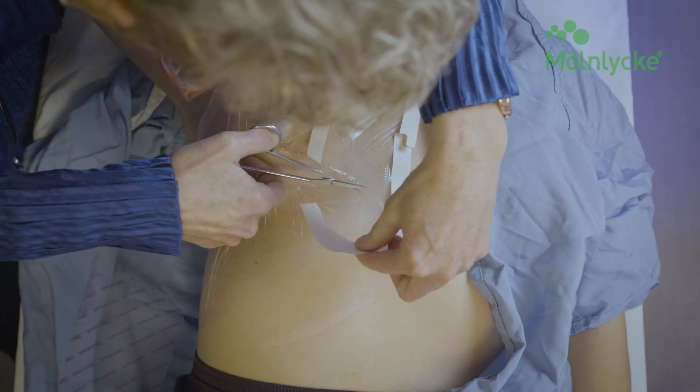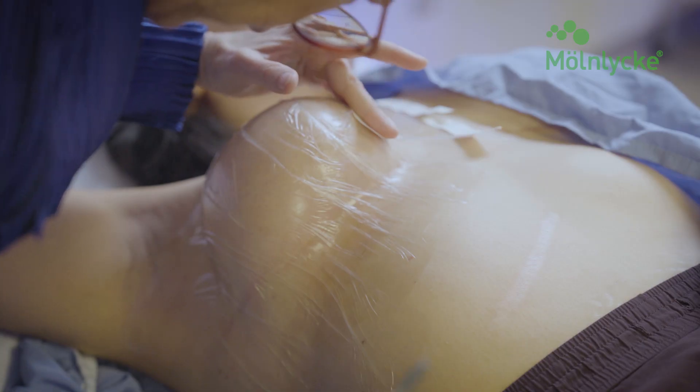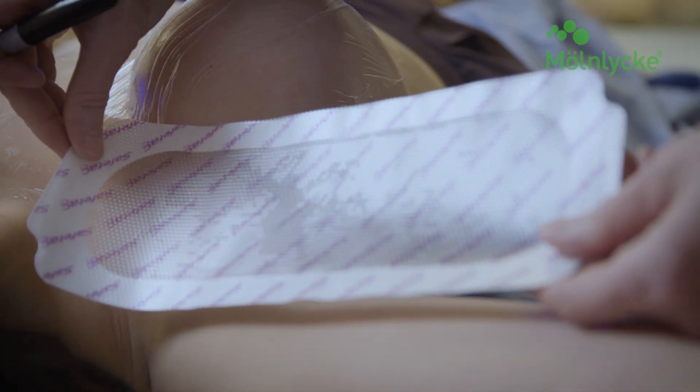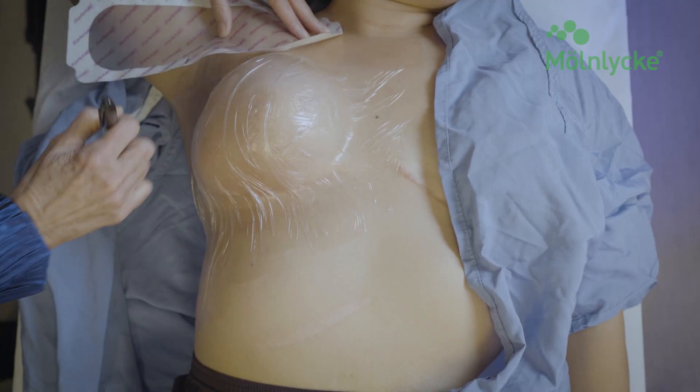Please note: patients with a smaller chest area may only need one 15 x 20 cm sheet to cover the entire breast, inframammary fold, and upper abdomen. Generally, the longer sheet is easier to use to ensure complete coverage under the breast and upper abdomen.